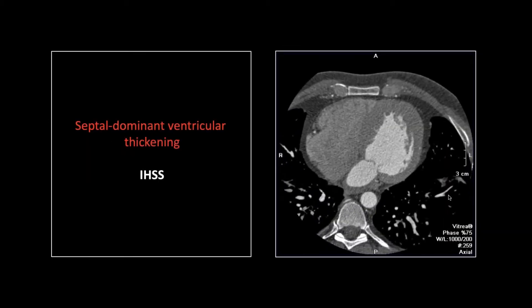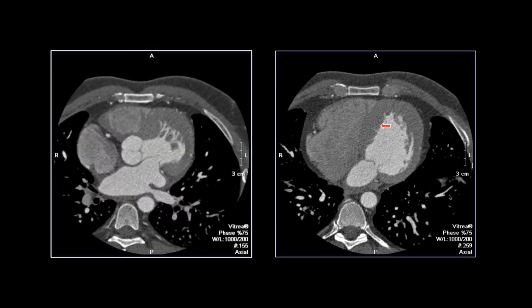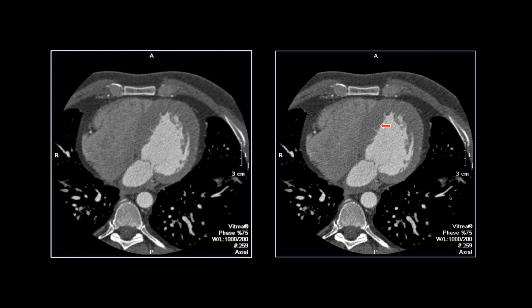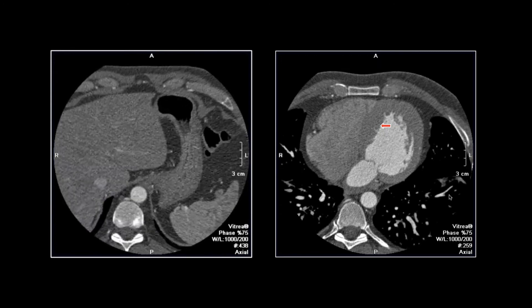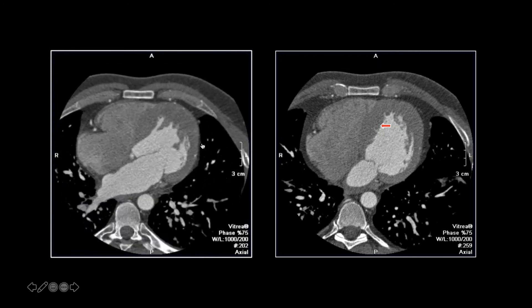Our next one is IHSS — asymmetric septal predominant left ventricular hypertrophy. You can see that free wall, the left lateral left ventricle wall is really pretty normal in thickness. So this is a typical distribution of hypertrophic cardiomyopathy, IHSS or subaortic stenosis. You can see that septal portion of the myocardium much thicker than the other portions, and this typically causes a shouldering.